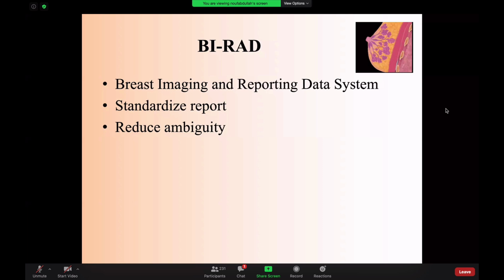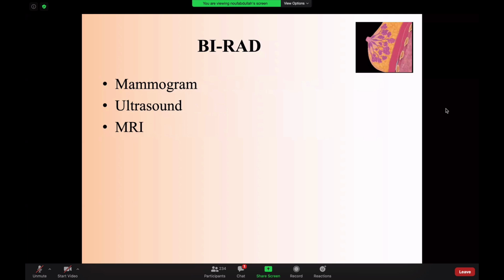And you probably would know the same if you've been through PI-RADS of the prostate, LI-RADS of the liver. It's the same idea. And fortunately, we have 3 BI-RADS lexicons. Because we use mammogram, ultrasound, and MRI for interpretation of breast imaging, we do have a lexicon for each modality, and this is great.